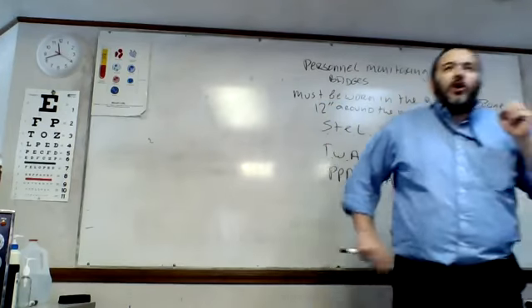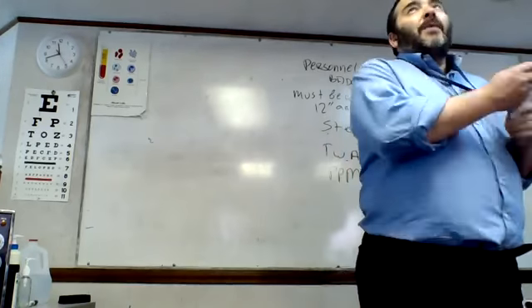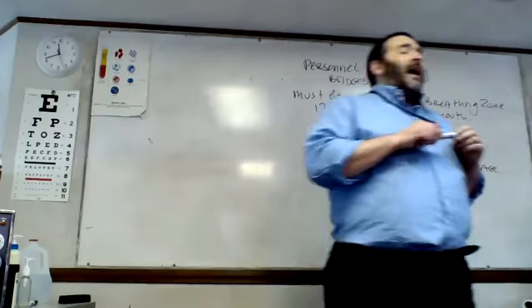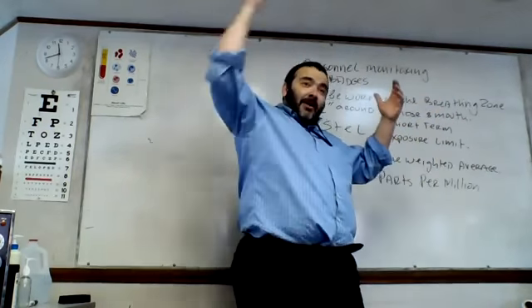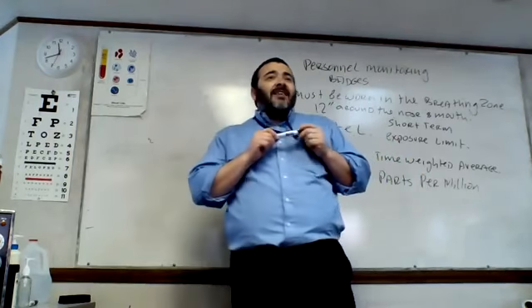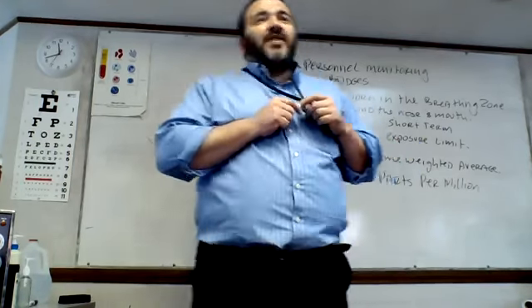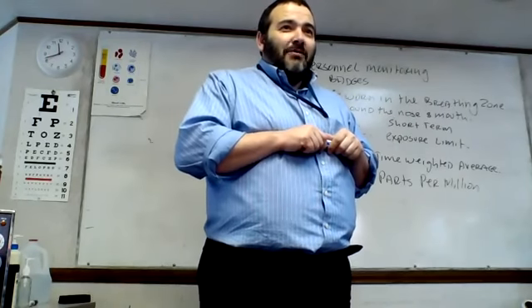Now, I promised to talk just a little bit more about... oh, by the way, places where we handle ethylene oxide, we also have not just personnel monitoring, we have facility monitoring. So we have things just like we have, for example, a smoke detector, we have an ethylene oxide detector. So if there's a leak, it goes off: get out, stop breathing.